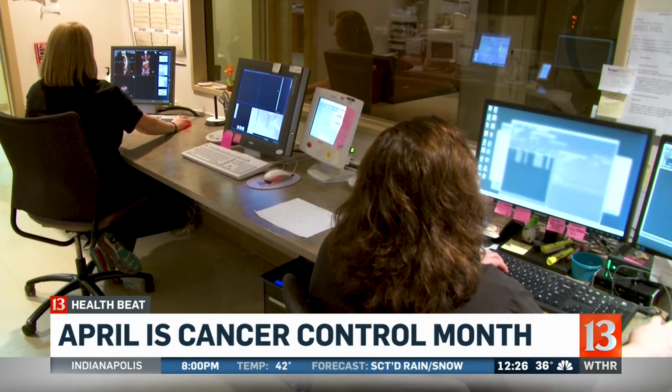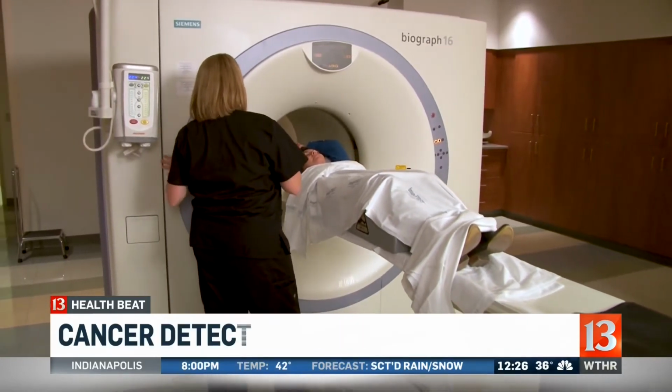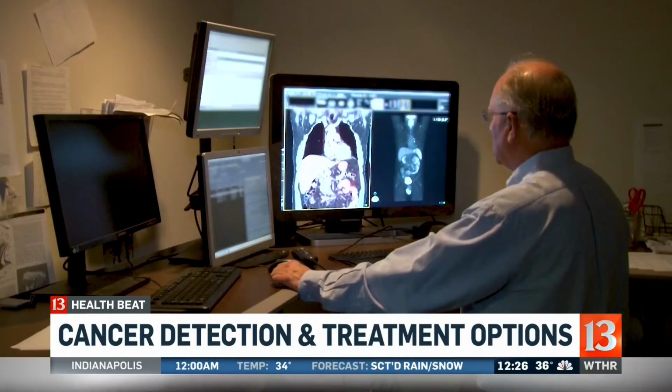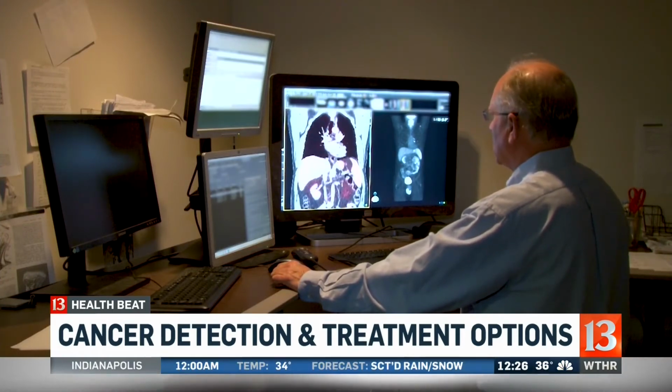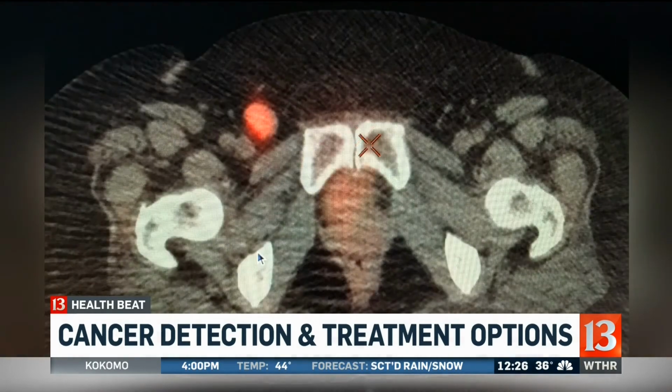If the patient has a tumor, the tumor cells are not as developed as your normal cells, and they can only use glucose. So the tumors have to have glucose, and the PET scan shows you where the glucose is, and we merge the two scans together, and you can see where the active glucose is, the tumor. A lot of the images that we're seeing here on the TV screen give us an idea of this.